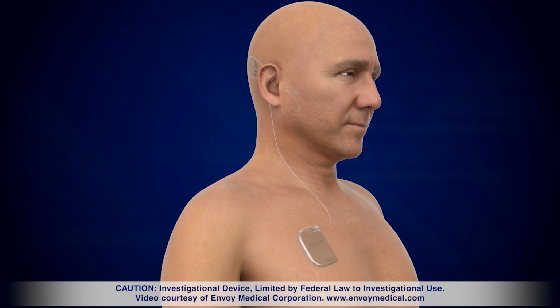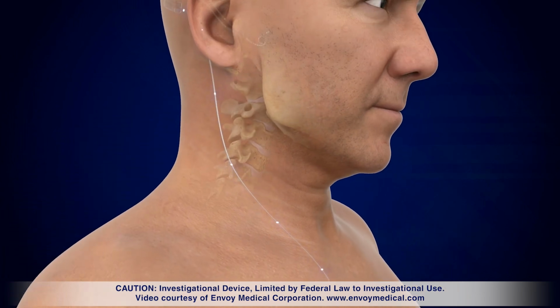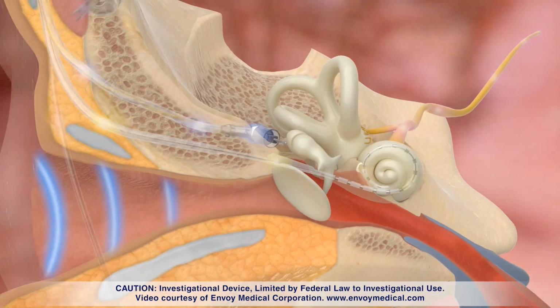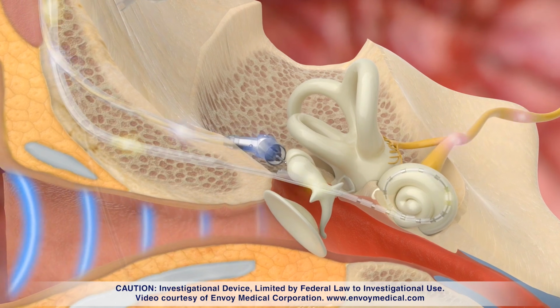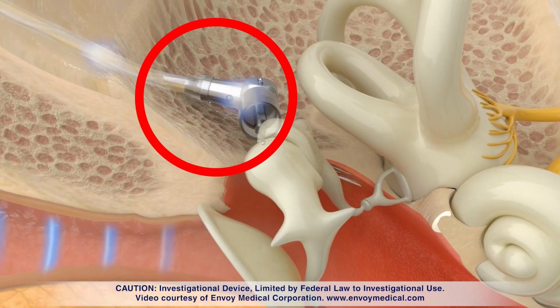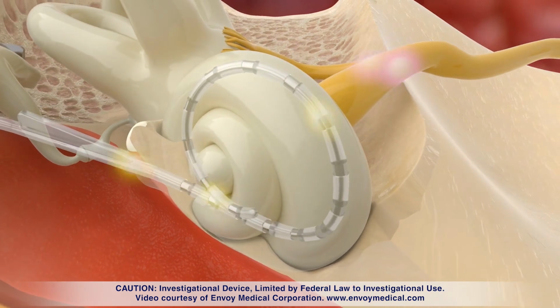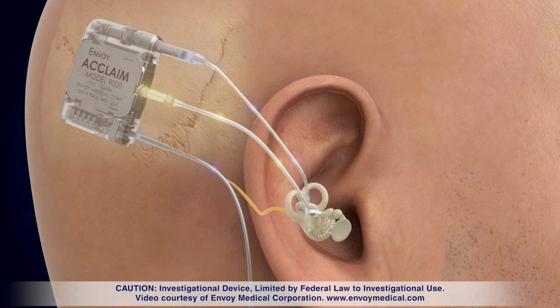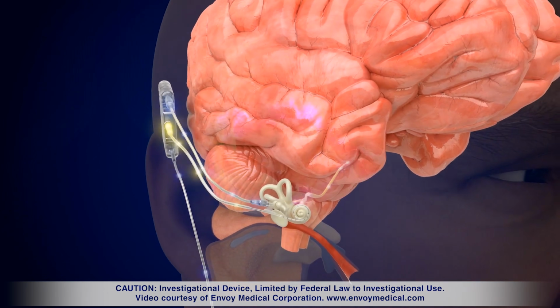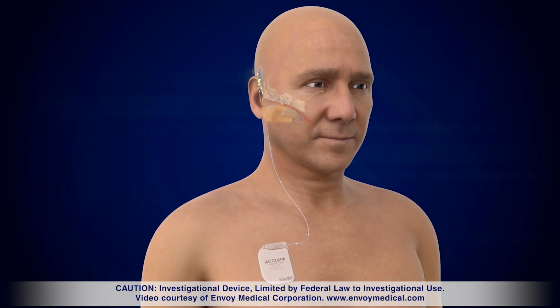Well, the Acclaim cochlear implant consists of an internal battery pack that is implanted under the skin of your chest, with a wire that provides power to the processor that is implanted under your scalp behind your ear. The implant actually uses your own eardrum as the microphone, which then stimulates a piezoelectric sensor that is attached to the incus bone in your middle ear. This sensor is able to pick up the vibration of sound and sends this information up to the processor and then converts it into an electrical impulse that travels down to an electrode array inside of your cochlea, and just like a traditional cochlear implant, stimulates your auditory nerve through electrical impulses instead of acoustic stimulation.